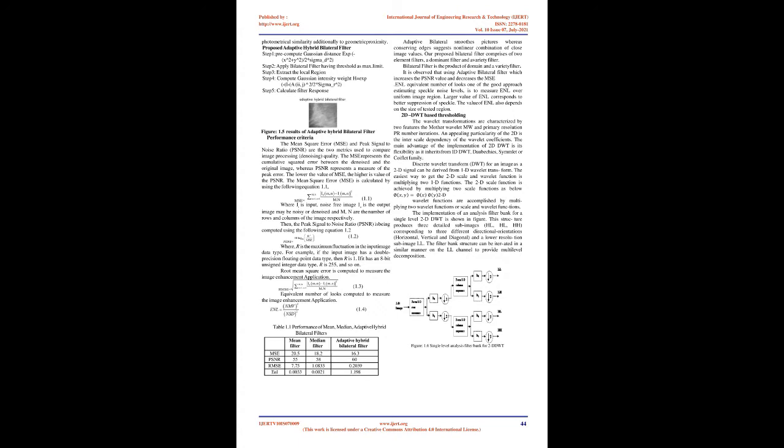Wavelet transform plays an important role in biomedical image processing. Wavelets were first introduced in medical imaging research in 1991, in a journal paper that describes an application of wavelet transforms for noise reduction in MRI images. A special issue of IEEE Transactions on Medical Imaging provides a large collection of the most recent research work on wavelets in medical image processing. Proposed noise removal algorithm.